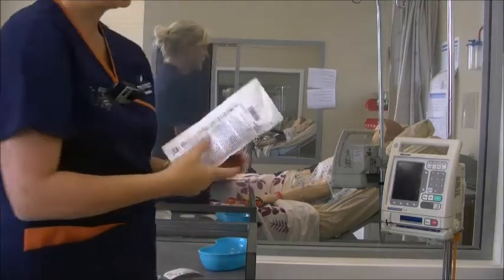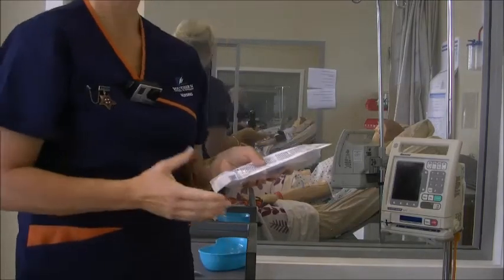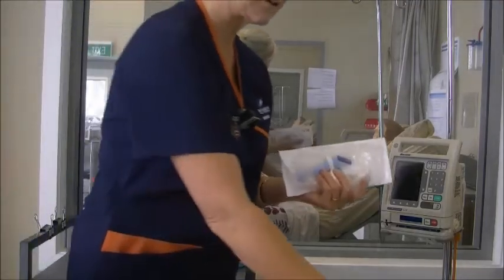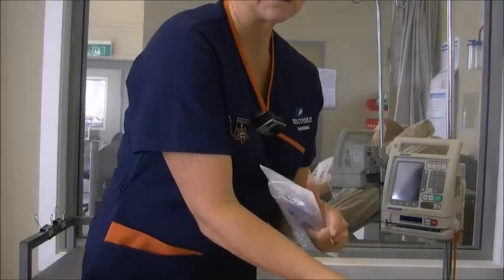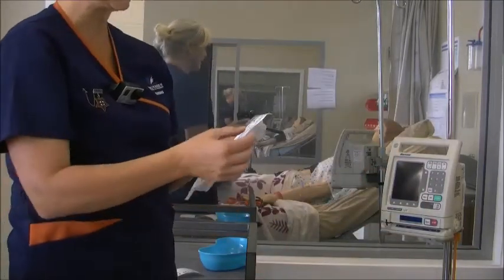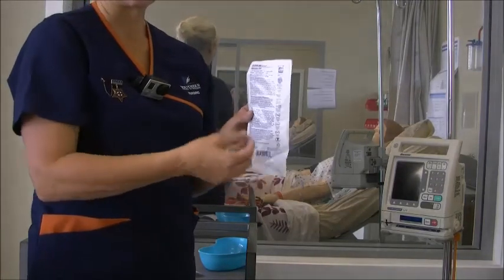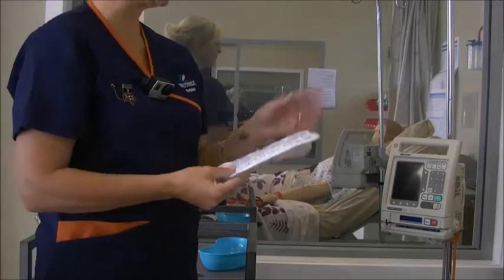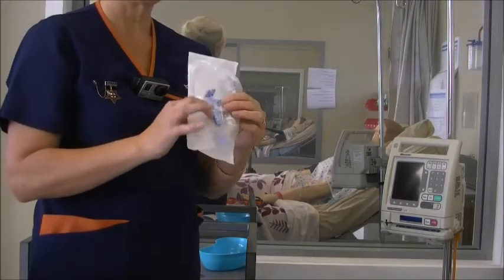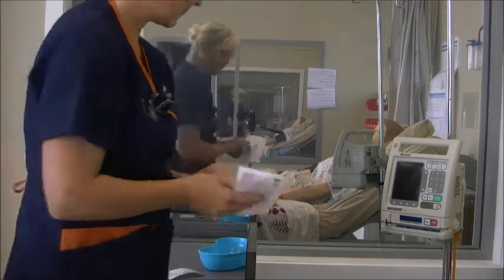The next thing I need is the appropriate tubing. So this is the ClearLink system, and I know that's appropriate because firstly it's in date, and then it's going to connect up to the interlink system that my patient has, so I know that that's the right tubing. It also tells me that it's a 20 drop per ml drip factor, so we'll need to work out what that is, because what I want you to do on the day is demonstrate how you would regulate the drip rate also prior to connecting it through the machine, so you need to know how to do that as well.